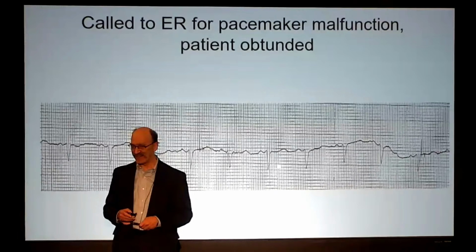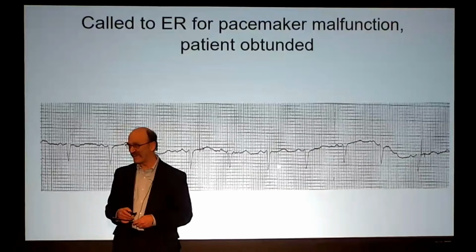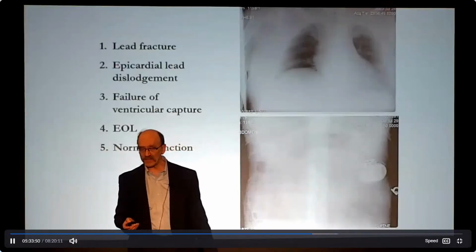He's into ablation. And he would call me and say, Dad, would you talk to this ER doc for me? And I'd talk to the ER doc. I'd say, look, when you're going 100 a minute and the pacemaker lower rate is 60, it's not needing the pacemaker. That's the only thing I can tell you. And the spike rate is really slow, right? I looked at the EKG and said, what kind of pacemaker is this?